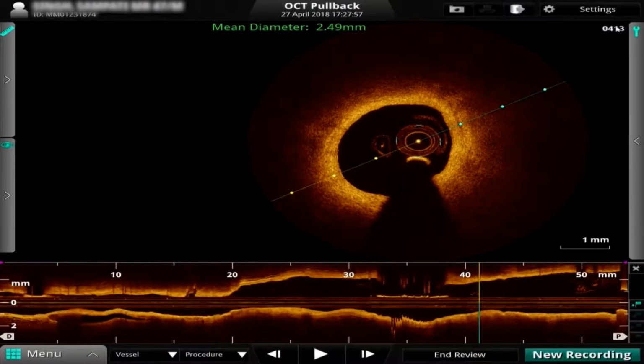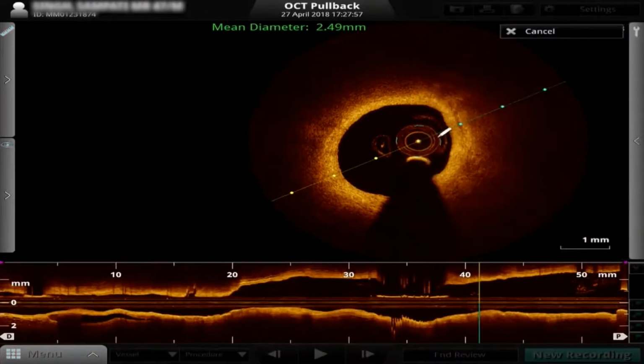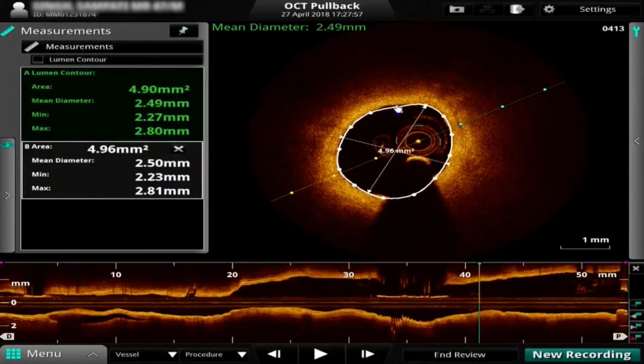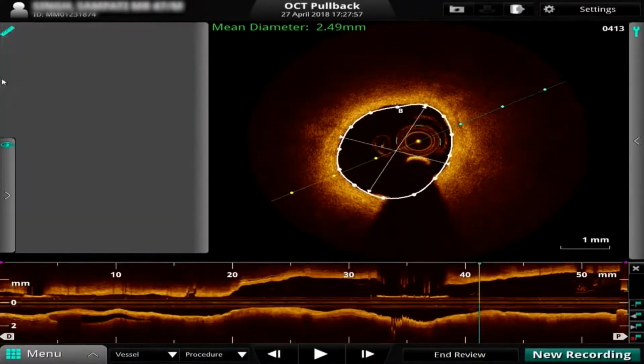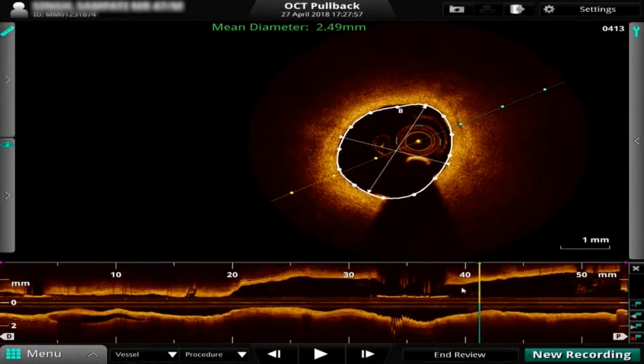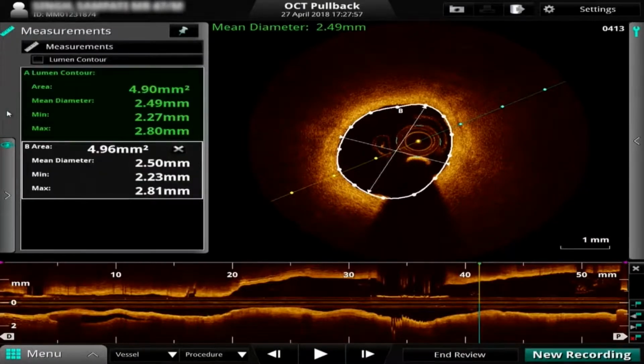You may measure the area here. Is it the LAD segment just before the bifurcation? Which segment of the LAD is that? Is it before the bifurcation? No, this is left main. This is the left main segment. The left main where the lesion is, this is that segment.